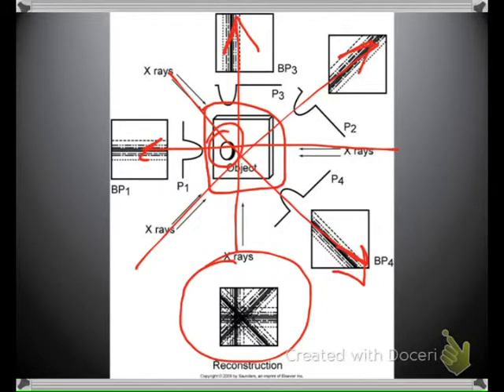As you can see, there is a dot on the inside, but there's also a lot of excess noise. And so the result of this is that we have an unsharp image. Ultimately, this resultant lack of sharpness proves to be no longer useful in producing a computed tomography image.